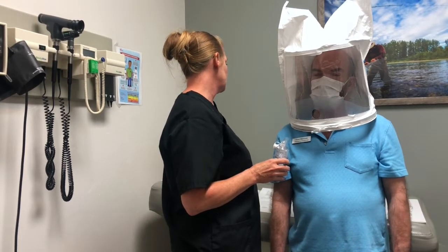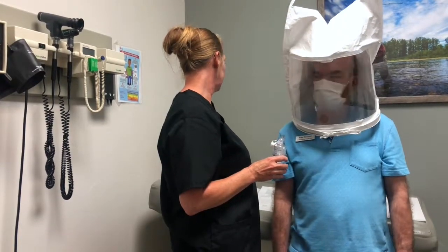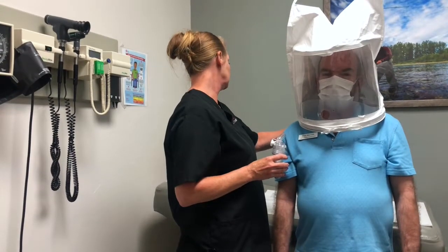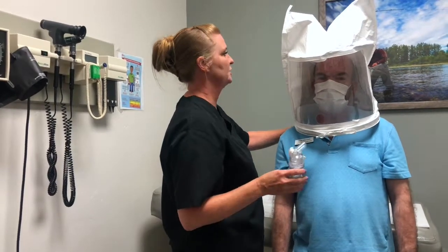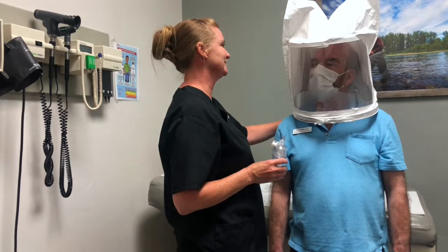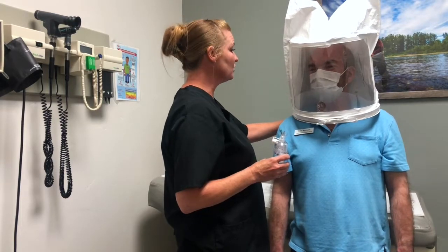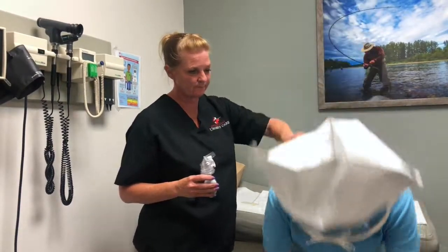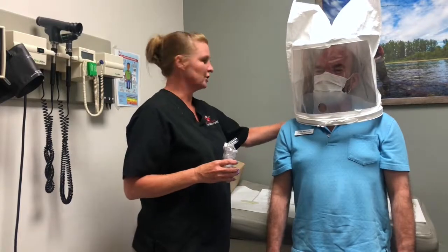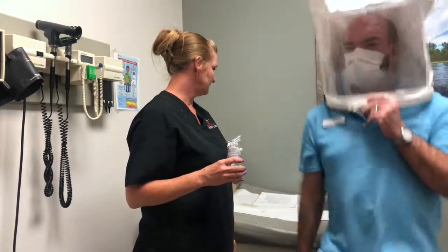You are supposed to take a deep breath, turn your head side to side, then up and down and inhale deeply. Then you need to talk — do some ABCs, sing 'You Are My Sunshine,' whatever you want to do. Then you're going to bend over and touch your toes — I'm going to hold your hood on. And up. Then you're going to jog in place for 10 seconds.